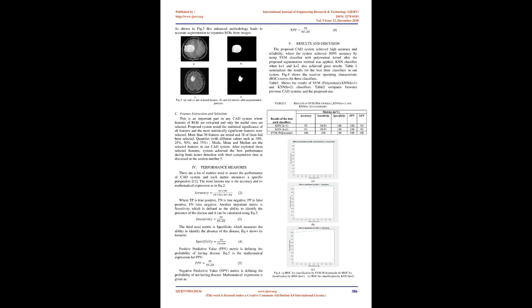Asgafarik et al. [10] provided a system to detect brain tumors and classify these detected tumors. The proposed CAD system used complexity measures and texture features which were extracted from MRI images. They used chaos theory to estimate complexity measures such as Lyapunov exponent, LE, approximate entropy, ApEn, and fractal dimension, FD. In addition, texture features such as gray level co-occurrence matrix, GLCM, and discrete wavelet transform, DWT, based features were exploited.